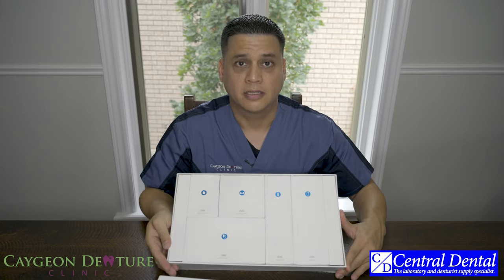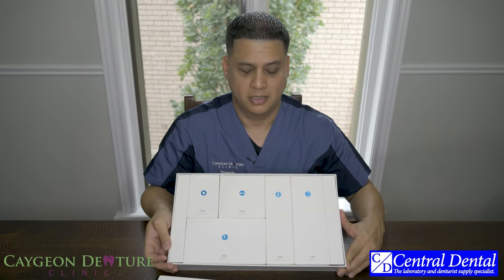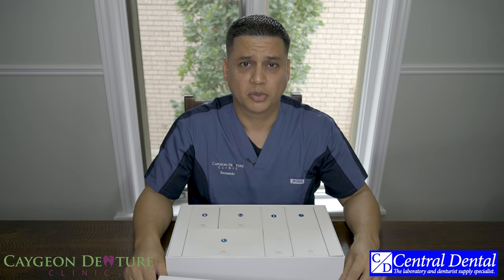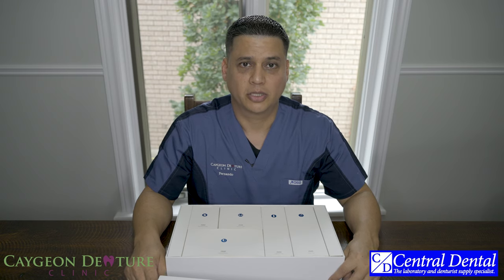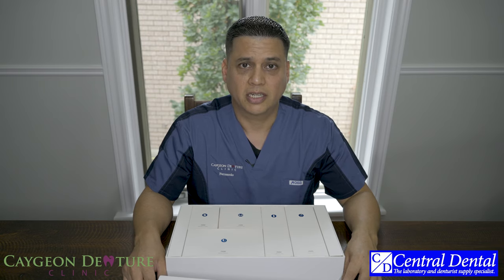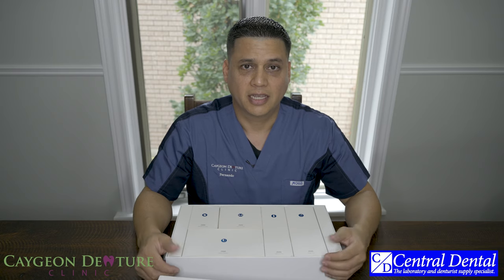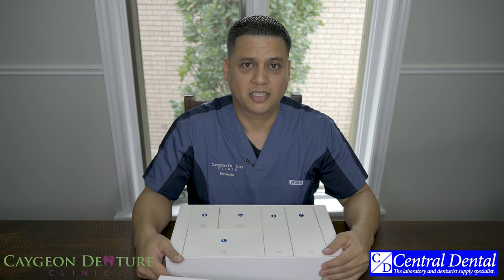So this is the contents of the Medit DIOS 4.0. It's extremely intuitive. They just released a new software update which has made the dental workflow a lot easier. The scanner does take some practice and time to really get used to and understand how it scans the mouth, but I'll be making a video on that as well, so stay tuned and I'll teach you how to use it.